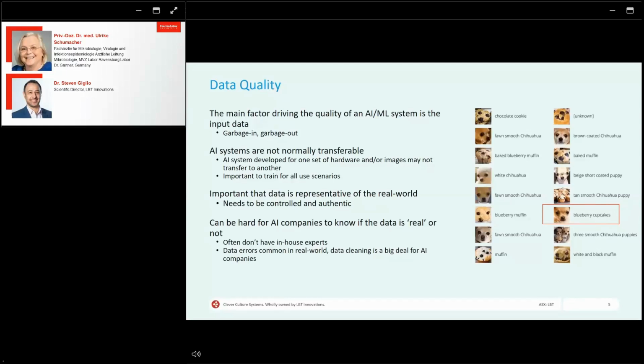If you were to put a camera through the top of the microscope to take an image, there are different influences of lighting, color illumination, different lenses and quality of lenses, and they all have a very significant impact on the acquisition of the image and therefore the way the data is interpreted. And so it's important to have very broad training scenarios to capture all those variations.